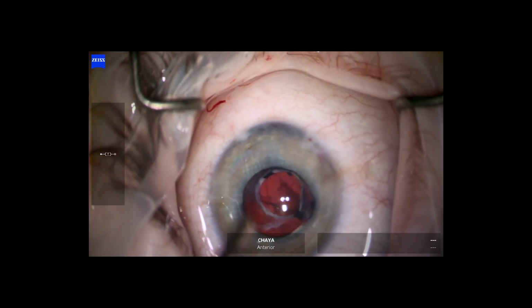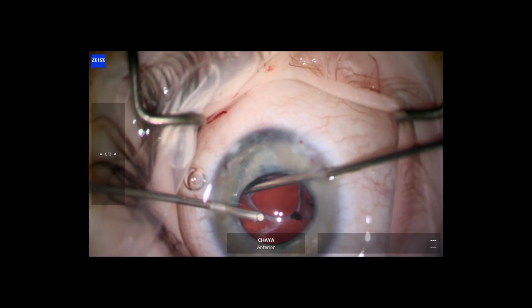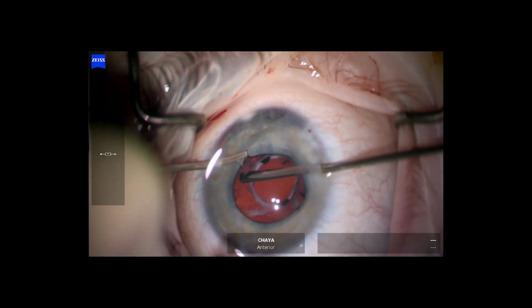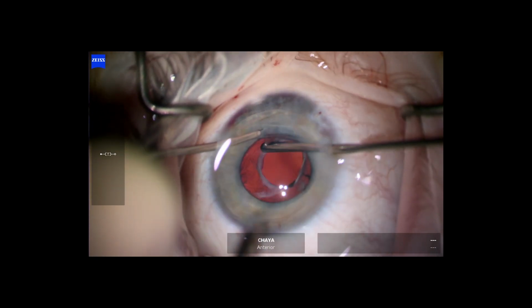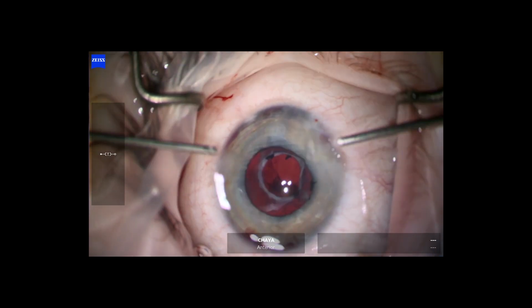I fillet or cut open the anterior capsule to access the Sommerings ring just peripheral to this fibrotic tissue. The capsule is much thinner here and easier to cut. You can make multiple cuts or you can sweep side to side with the blade to get the cut and access needed to the Sommerings ring.